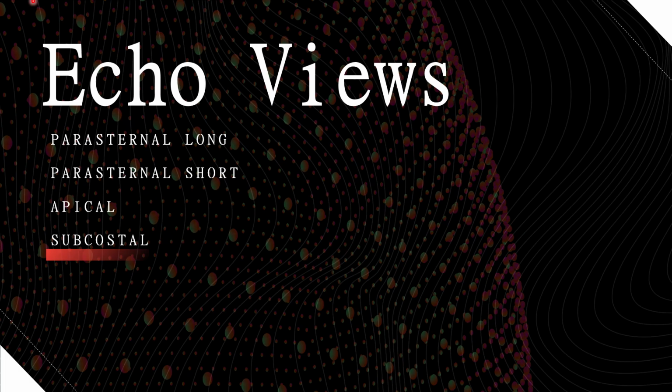Review: we went over the parasternal long, parasternal short, apical, and subcostal views.